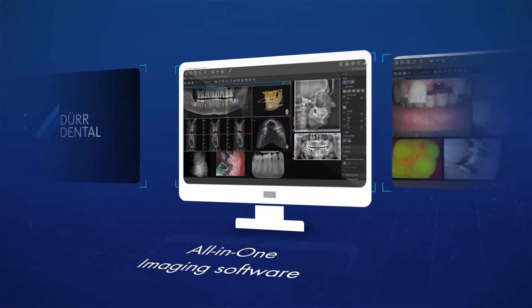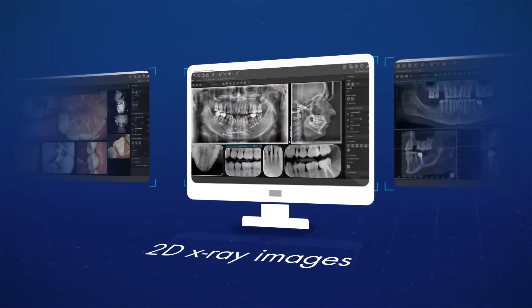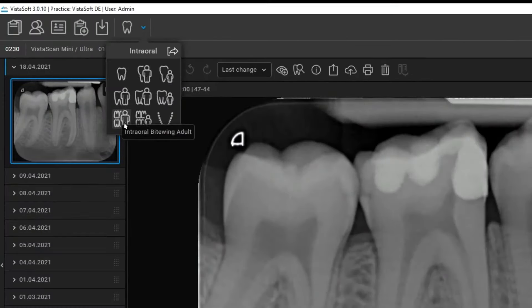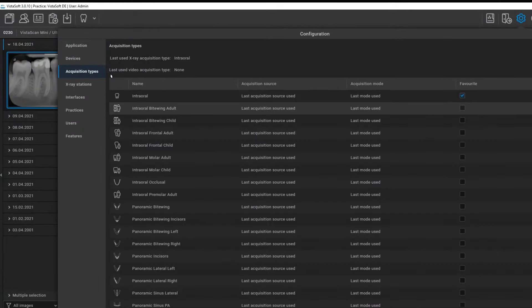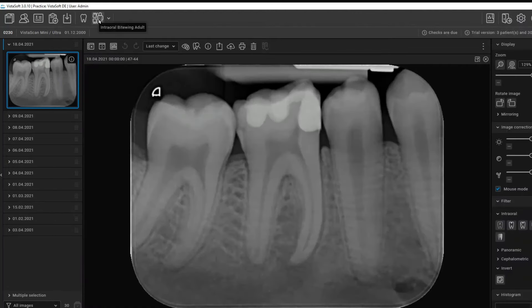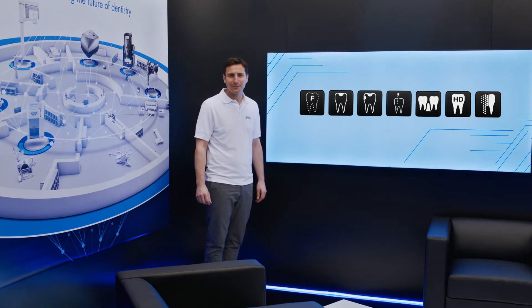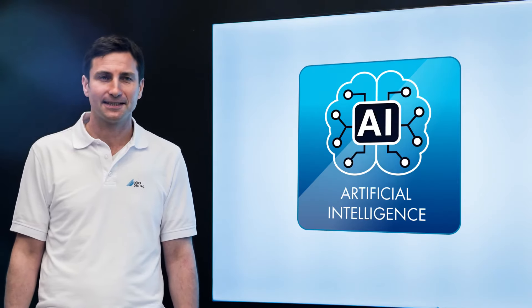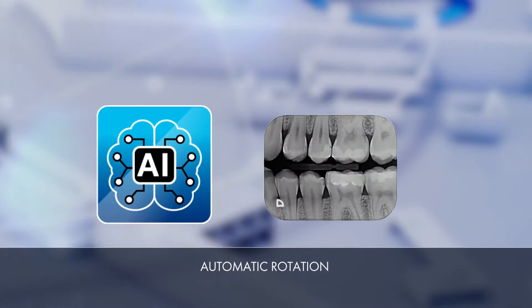Also included in the scope of delivery is VistaSoft software. VistaSoft is the all-in-one imaging software from Dürr Dental and can completely manage camera images as well as 2D and 3D x-ray images. Thanks to the modular design and the one-click principle, all main functions can be reached with just one click. Fast and well-thought-out workflows ensure efficient operation. Various image filters are available for different applications and scenarios, and thanks to an algorithm based on artificial intelligence, intraoral images are automatically displayed with the correct orientation based on the anatomical features present in the image.